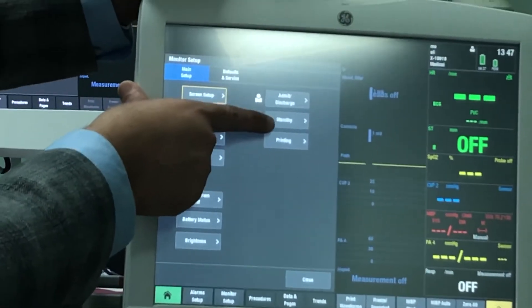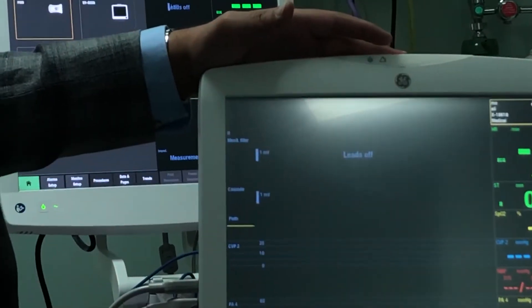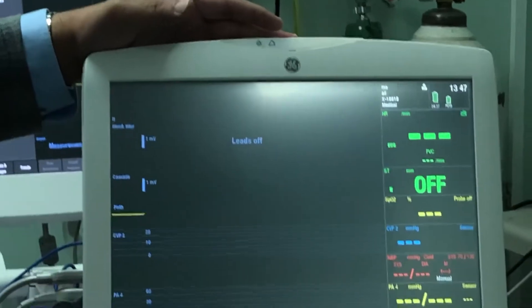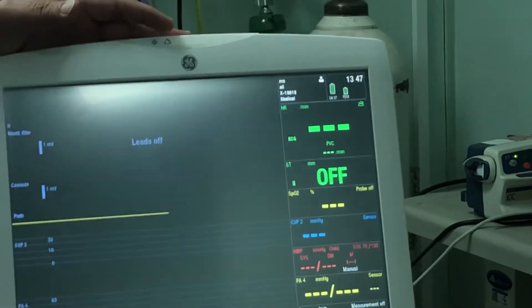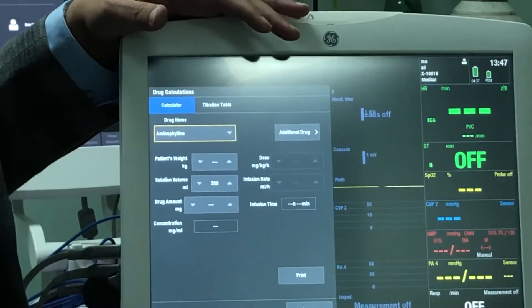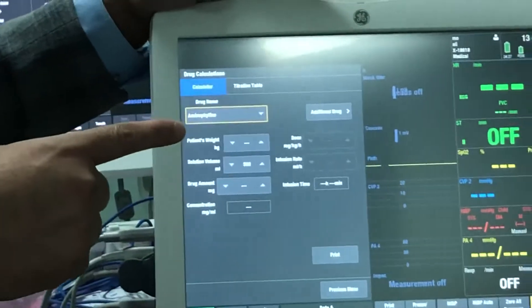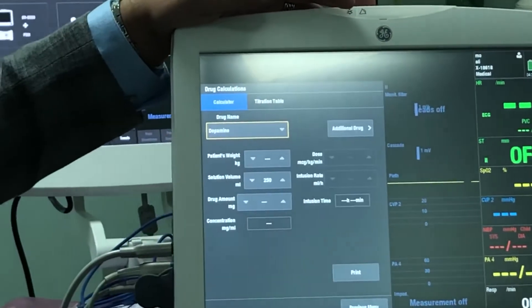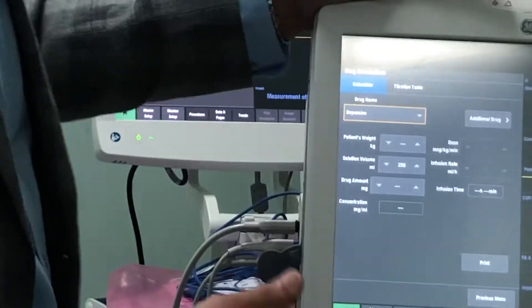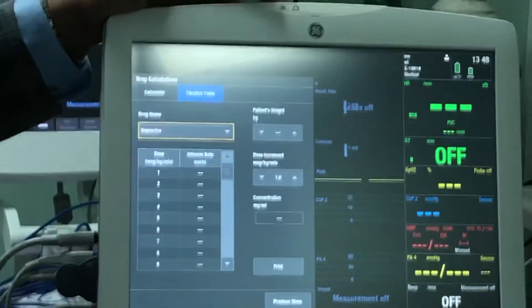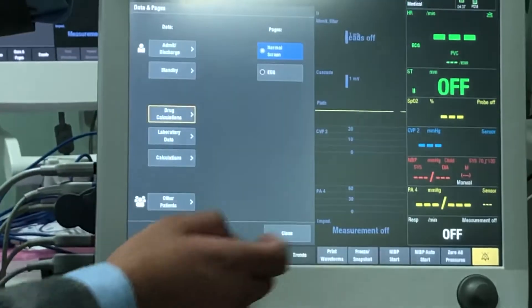There is an admit and discharge button as well as a standby button accessible from this box. Under procedures you can do cardiac output through a Swan-Ganz catheter, catheter insertion, ST trend analysis, and more. Under data and pages, there's a drug calculation button — so if you have a drug that needs an equation, like dopamine, you enter the doctor's order, dosage, and patient's weight, and it calculates the infusion rate automatically. There's also a titration table for medication titrations, and you can print or save all this data.